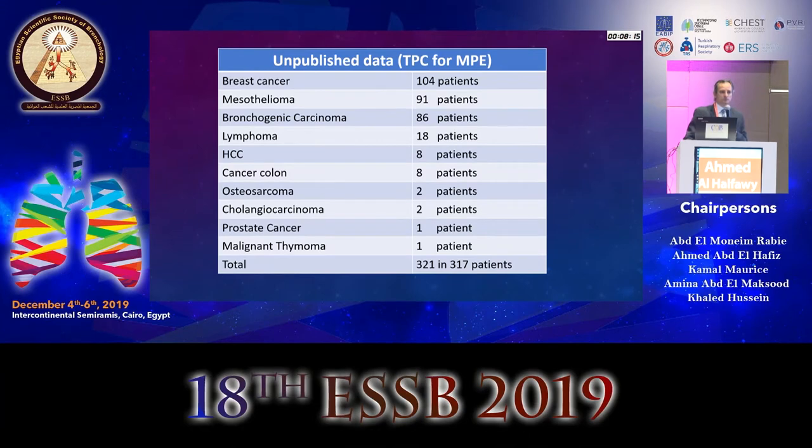I'll show you some unpublished data I'm working on with Dr. Light. Now, I have 321 catheters inserted in 317 patients. One patient had two catheters at the same time, and others had one removed and another placed on the other side.